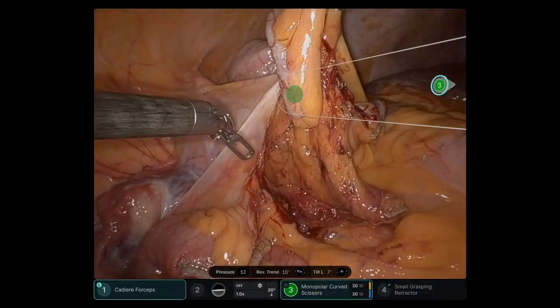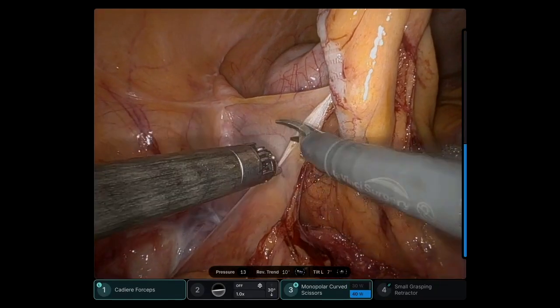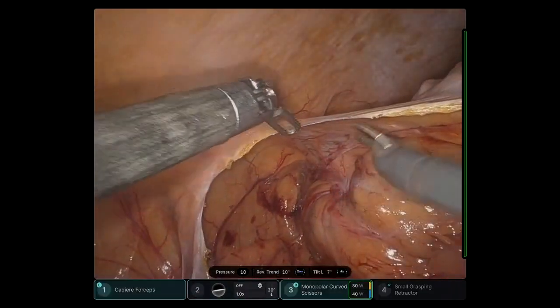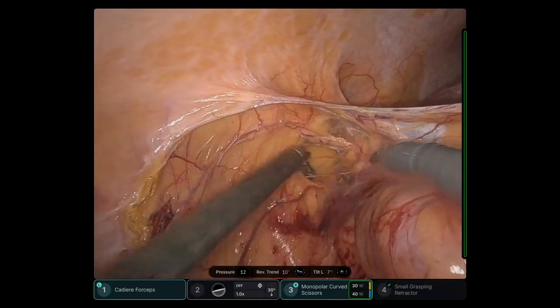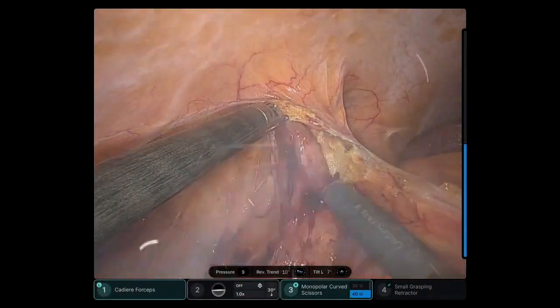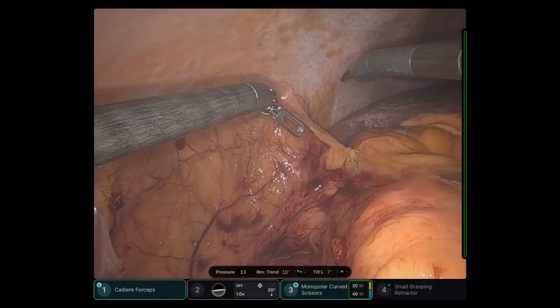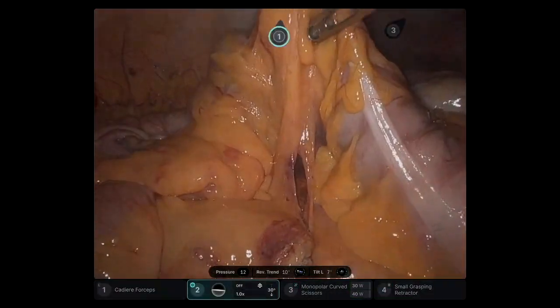I continue the dissection, in this case lateral to medial. Here I'm increasing the coagulation energy so I can go faster, because this is a non-vital structure where I can use energy at higher levels to facilitate efficiency of the movements. The ports also have an included automatic desufflation, very similar to an AirSeal device, that prevents the camera from fogging or getting an obstructed view because of smoke.